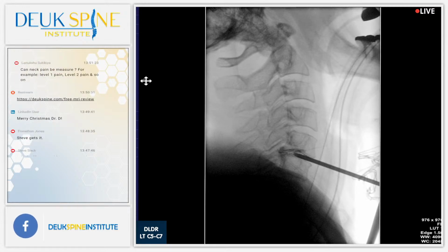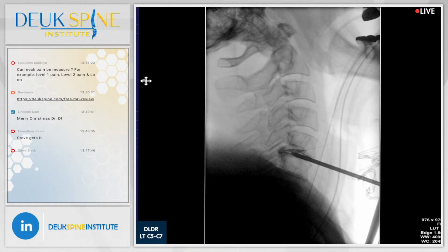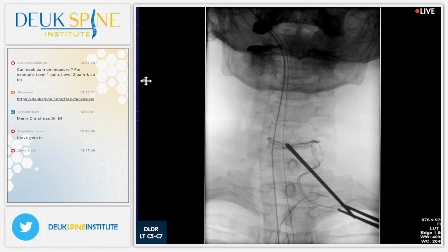Shot. All right, perfect. There it is. You guys see the dye in the disc? Yes, we do. It's leaking out. Let's get an AP. Shot. AP is a front back, anterior posterior. Shot. All right. Wow, look at that. You got tears on both sides. Show us the tears, Jordan. One there and a really long one there. That's where the pain comes from.